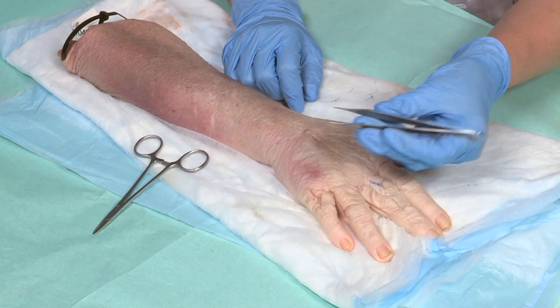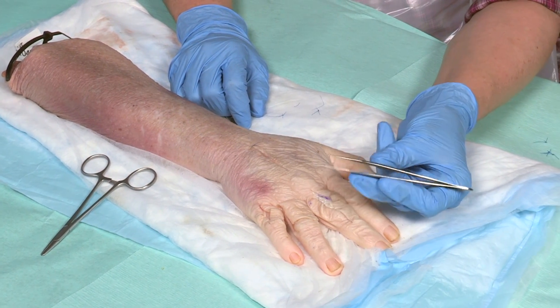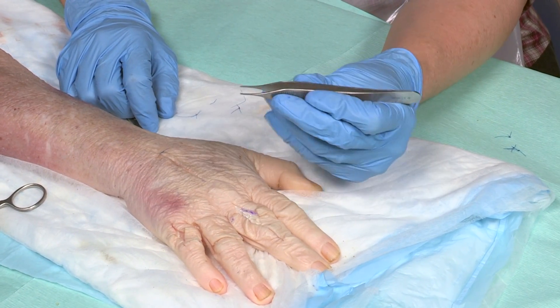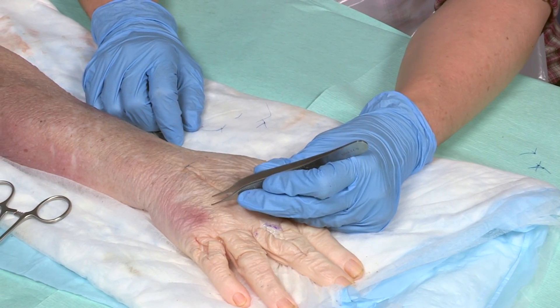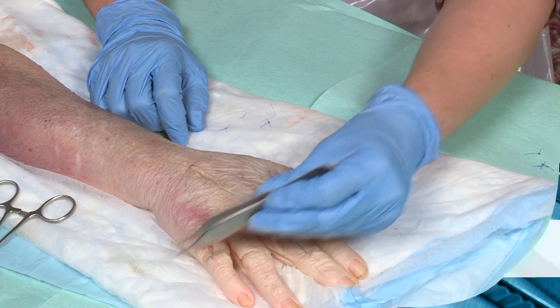To hold your forceps, hold them like a pen, not with a power grip. It's more difficult to pick the tissues up if the forceps are held parallel to the tissues. Use your thumb and index fingers to stabilise the forceps.